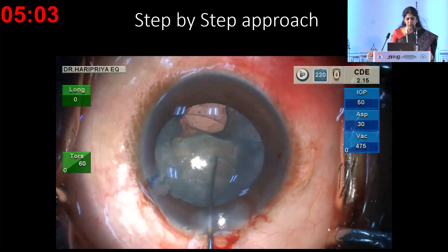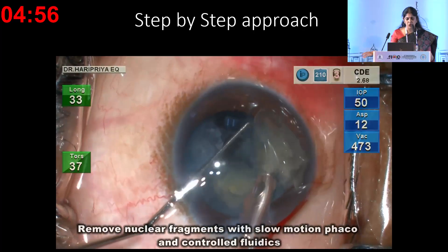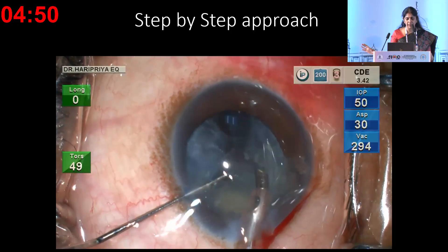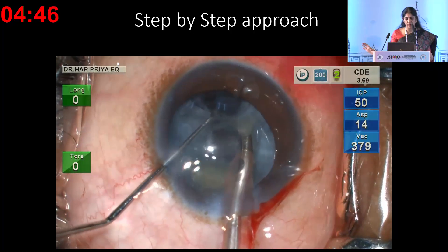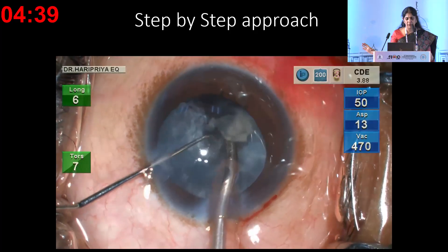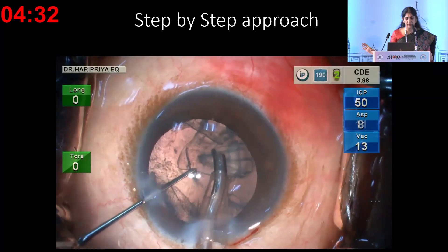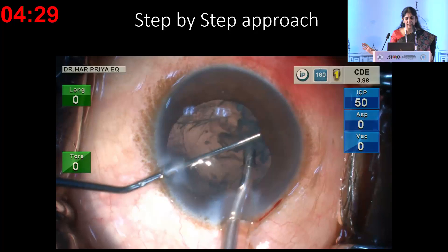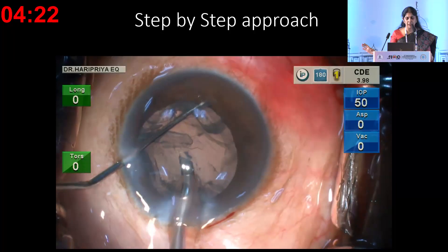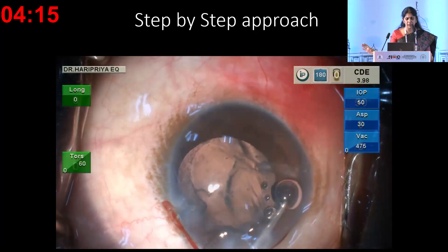In this patient with a PC rent, once the rent is identified, the goal is to ensure it does not become larger. Perform phaco away from the rent area, use slow-motion phaco with good chamber stability and fluidics, and keep fragments away from the rent. It's preferable to use the IA probe rather than the phaco probe to remove the epinucleus—that is a safer option. Once nucleus and cortex are removed, proceed with anterior vitrectomy.